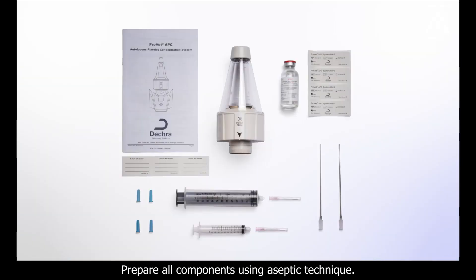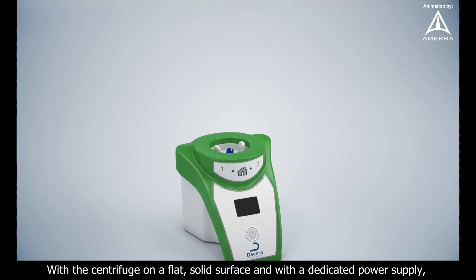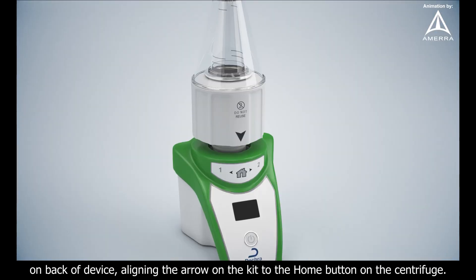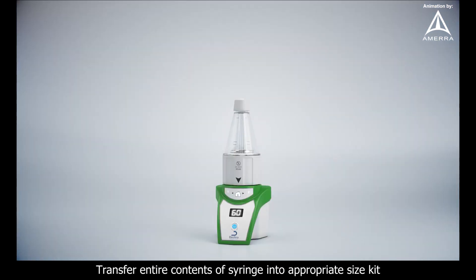Prepare all components using aseptic technique. With the centrifuge on a flat, solid surface and with a dedicated power supply, align and connect the disposable unit to the centrifuge by pressing down the gray button on the back of the device, aligning the arrow on the kit to the home button on the centrifuge.